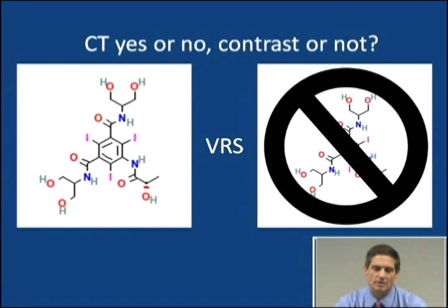If your question is, do I inject contrast, do I not inject contrast? If the opportunity exists to inject contrast when you're doing a CT, inject contrast. It will show you much more information than the non-enhanced study. Exceptions to that rule include, number one, if the patient has renal failure, has a high or elevated creatinine or increasing creatinine. Number two, if there's a personal history of contrast reaction with that patient.